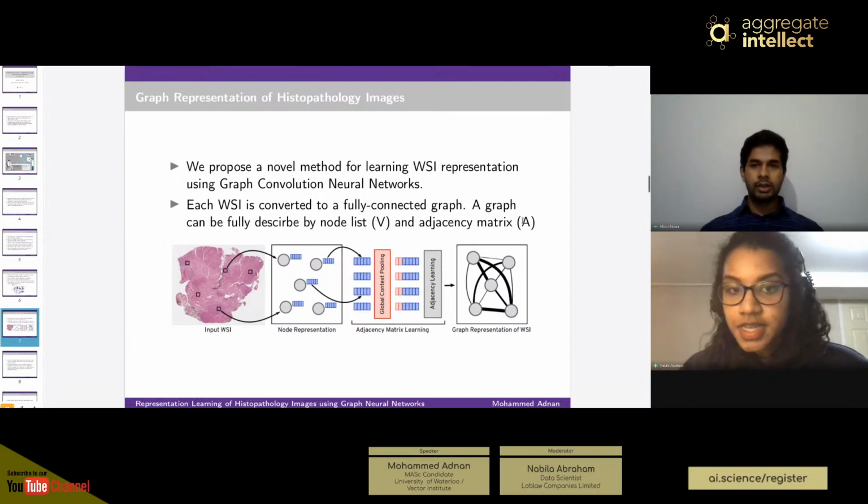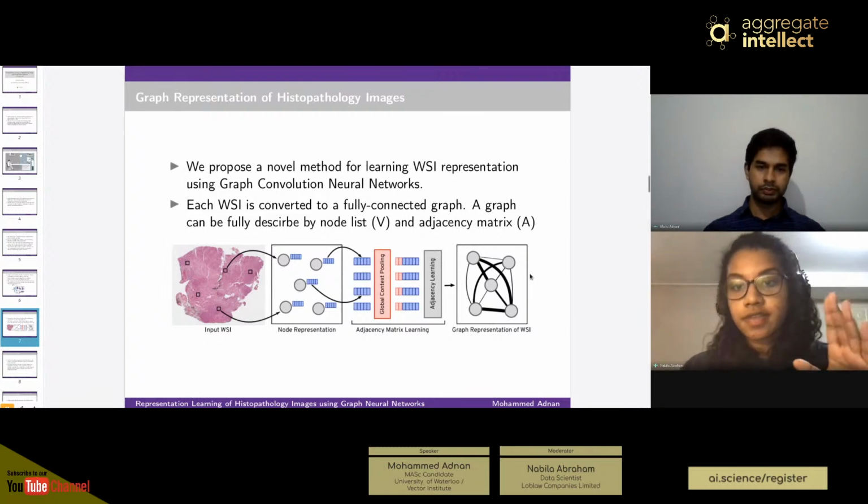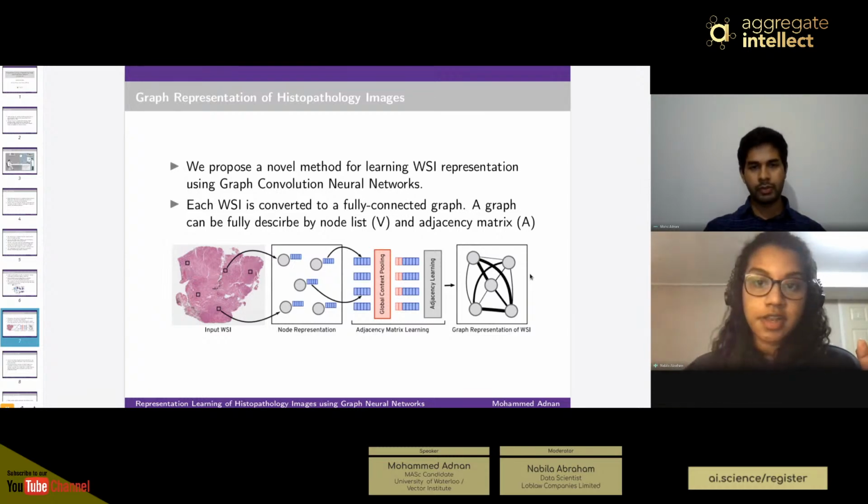Now we can use... Sorry, Adnan, can I interrupt you with a question? Sure. So to actually do one round of this, you need to have an adjacency matrix, right? And you're saying that we don't actually have this information before you start learning? Yes, that's right. Could you not use the fact that patch 1 is in the top left corner and patch 2 is a little further away? Could you use those distances from the actual spatial image to initialize the adjacency matrix?